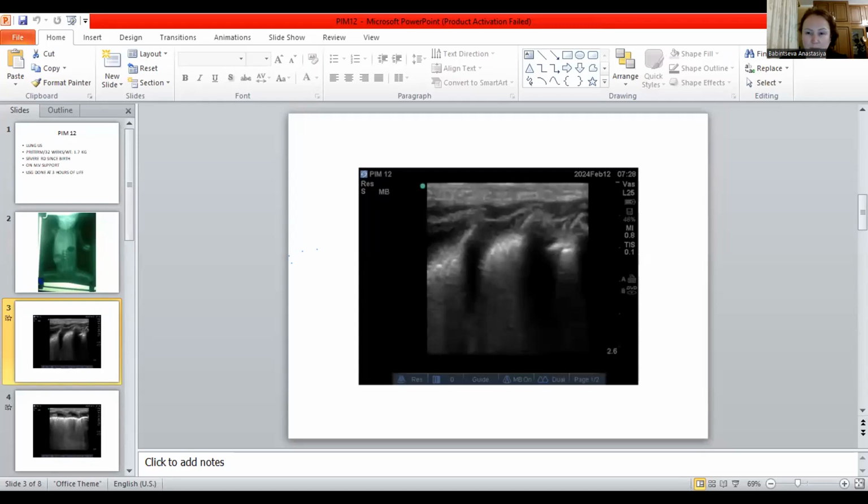In the beautiful images, Surjit, those areas where we saw, is it okay to describe them as a snowflake appearance? Yes. Dr. Leo would classically describe it as a snowflake appearance. Once you start seeing atelectasis of that nature, the snowflake appearance has disappeared. The classical description is of subpleural consolidations with static air bronchograms, but with a pleural line that you can visibly see. The ground glass appearance is usually still an A profile, but you tend to describe the snowflake in a more severe form of RDS. So, yes, you're right.